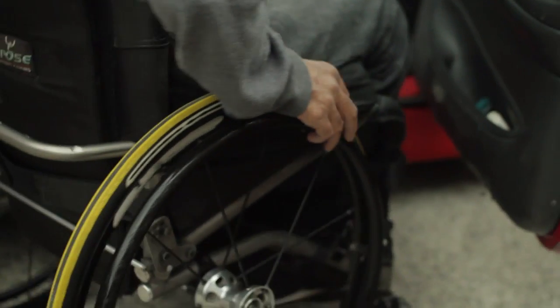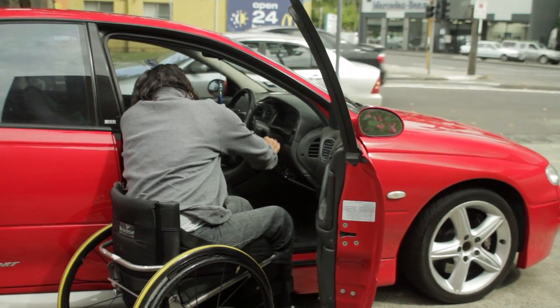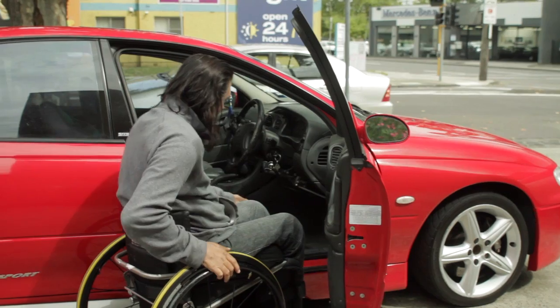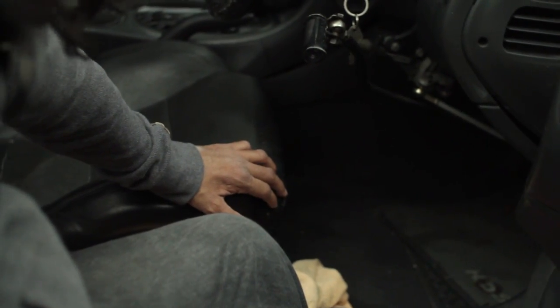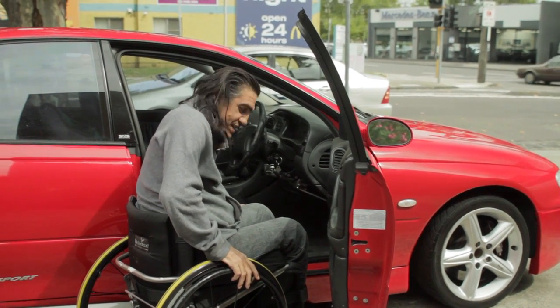So what I do, I go side on, put my brakes on, put the key in. Now, because I don't have triceps, I pretty much lock my elbows. Now, getting into the car, I put one hand on the corner of the car seat and the other hand on the tyre and pivot my body across onto the seat.